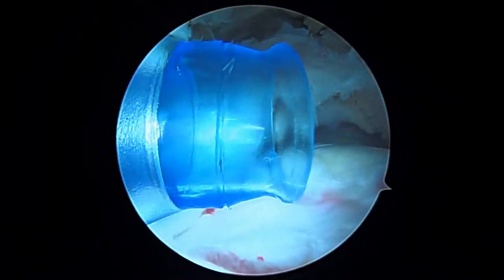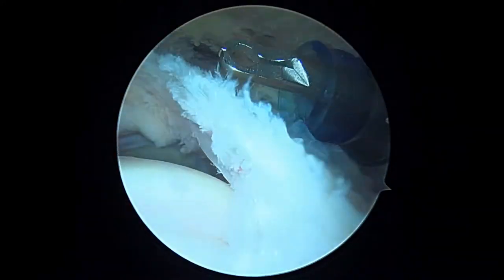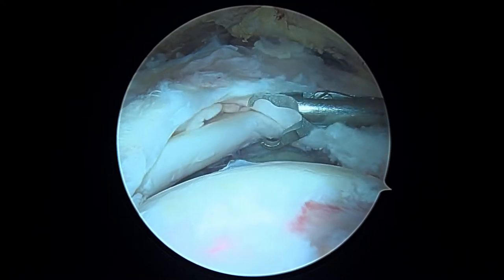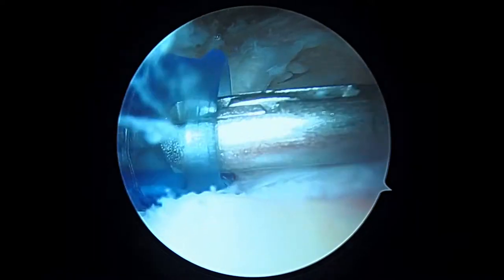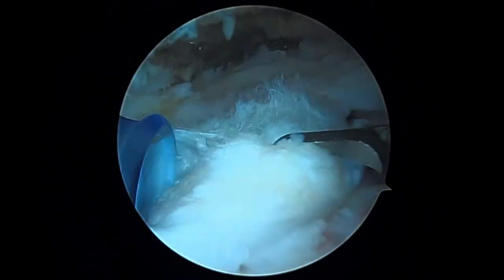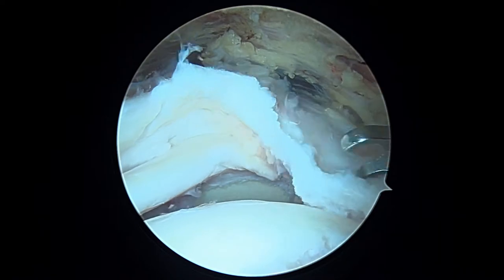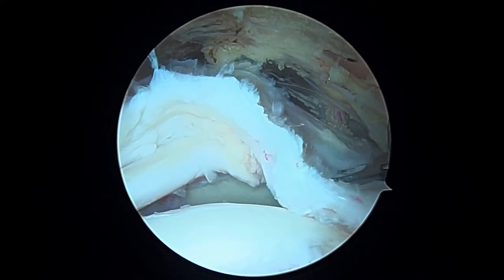We're looking at this big tear here. The front of your shoulder is to the left, the back is to the right. This is your biceps tendon, which is okay inside the joint, but you can see that this rotator cuff tear exposes it — we'd like to have this covered up. And this posterior leaf needs to go forward, so that's what we're going to work on.